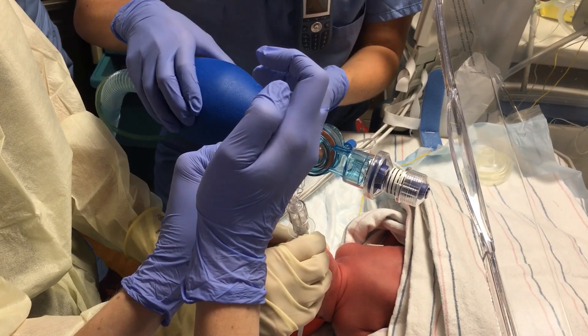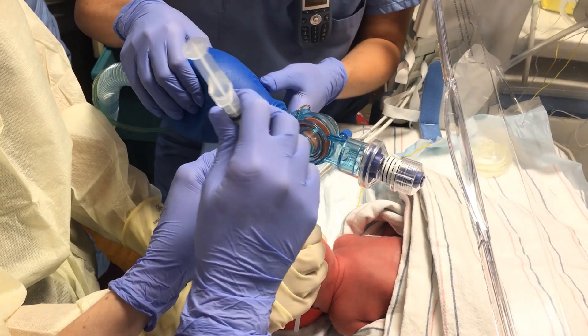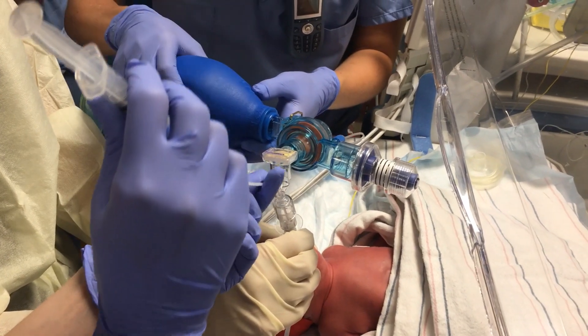You're getting bagged. Keep bagging all the way through. All right, that's 2 mls. She's still doing good. 130, sats at 100.